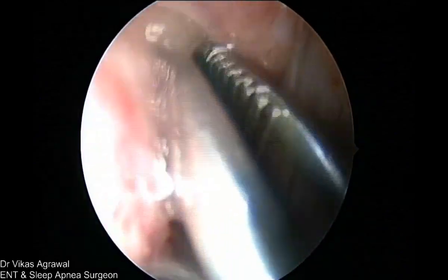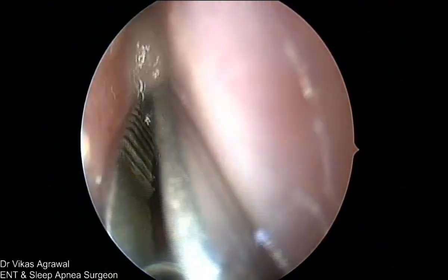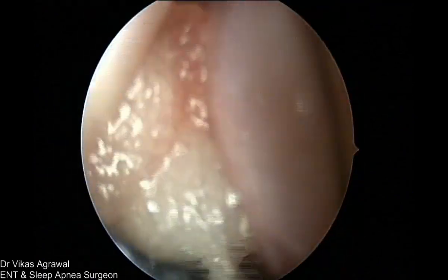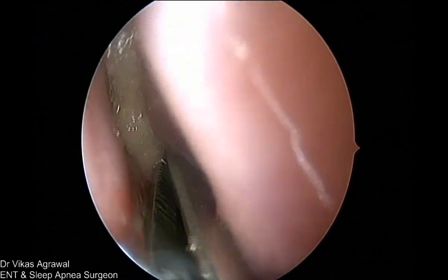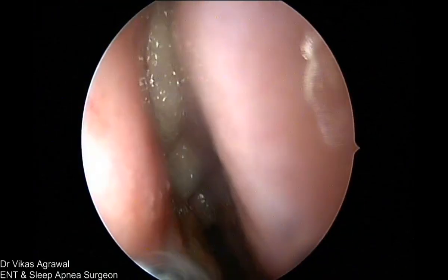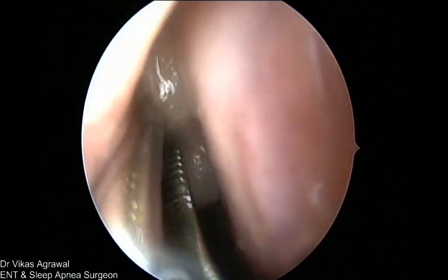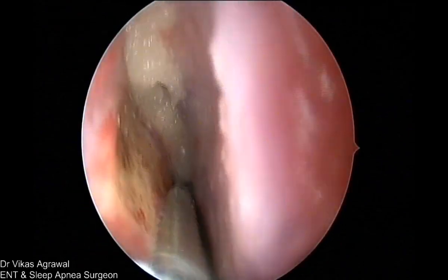So if you put some gel foam with Sepguard, is the sound okay or still going? So if you do that, then you will not get hematoma formation in the upper part of the septum. And this is simple gel foam. It doesn't cause any reaction even if you put it into the open sinuses. I routinely do it. This case obviously is not a sinus case, but this is the part done to prevent a septal hematoma in the upper part of the septum where we have operated.